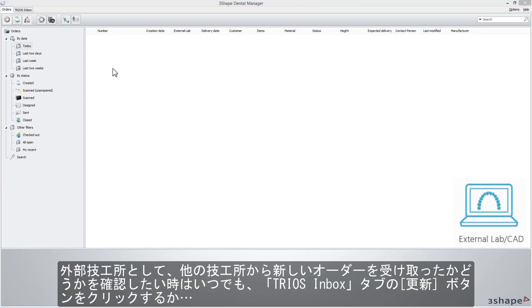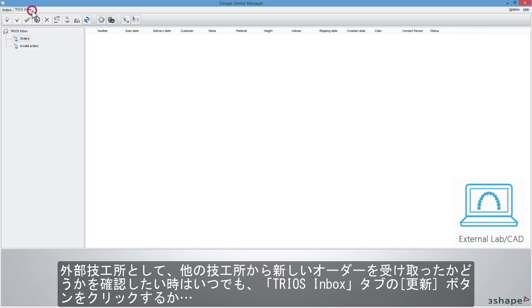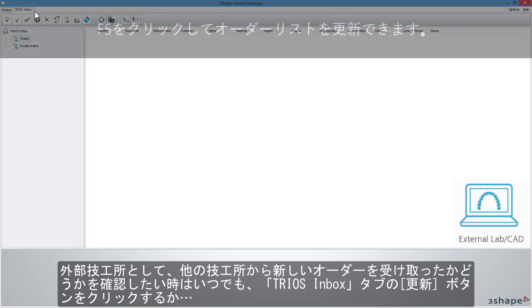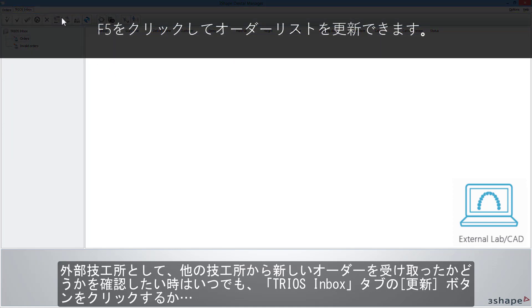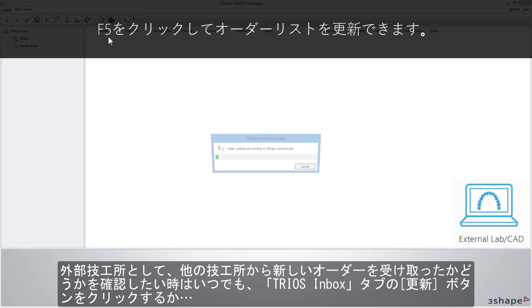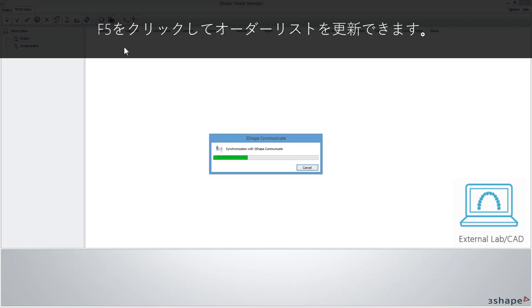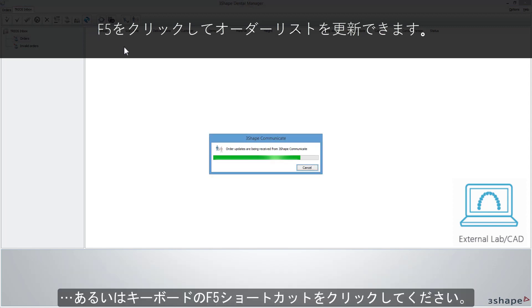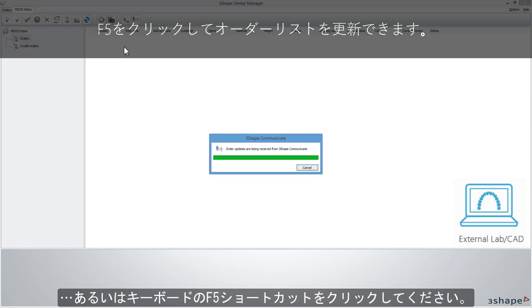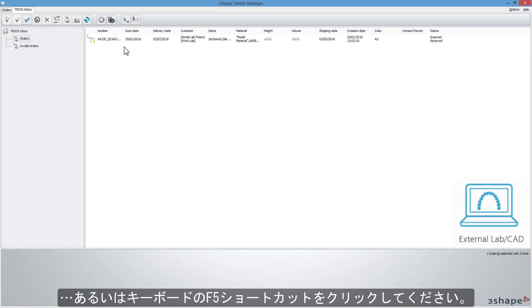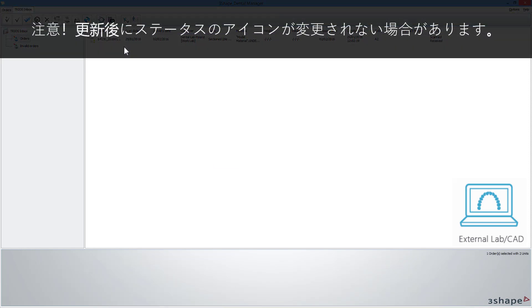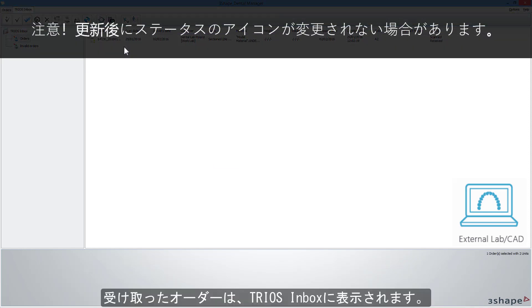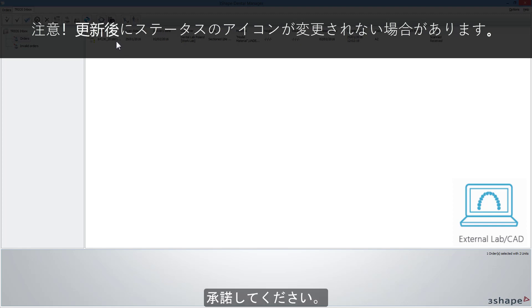As an external lab, whenever you want to check if you have received new orders from other labs, you can either click on the Refresh button in the TRIOS Inbox tab or choose the F5 shortcut on your keyboard. A received order will appear in the TRIOS Inbox.